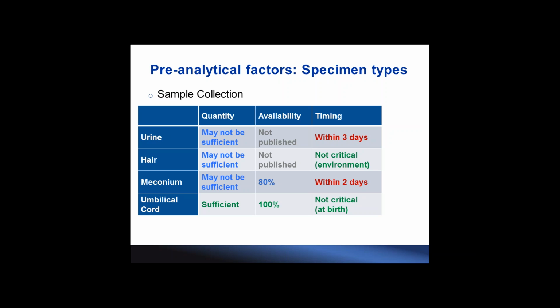There are some cases where babies show neonatal abstinence symptoms and are given drugs to treat them, and it turns out that drug shows up in the meconium testing results. So this history needs to be considered when we look at the positive results.